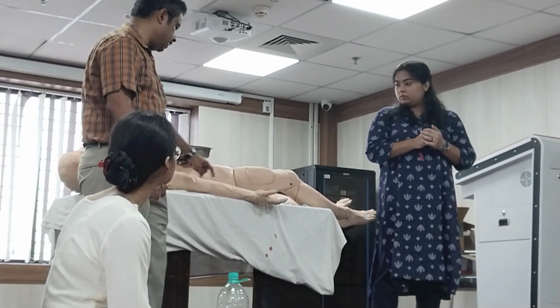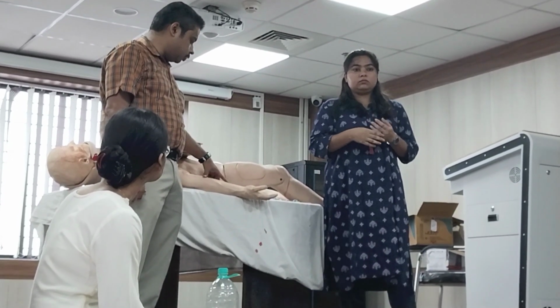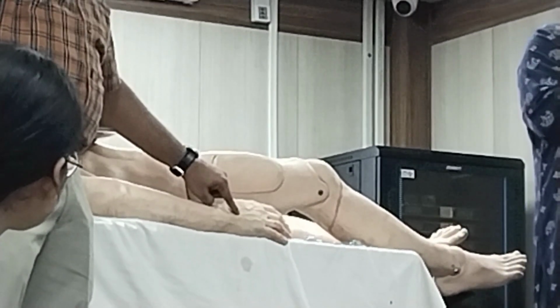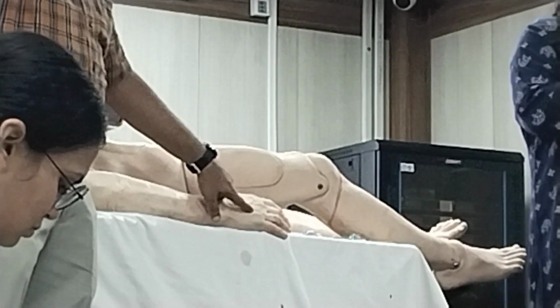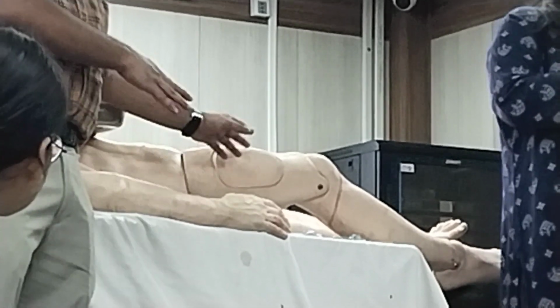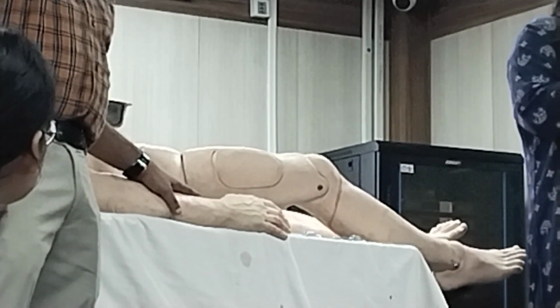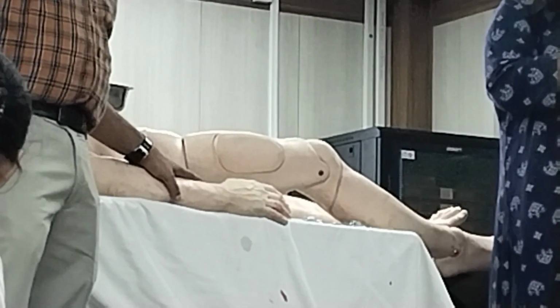As you can see here, there are some veins which are prominent and straight. We can choose them, or we can choose a straight vein like this, which will be beneficial. And you can clearly see the veins in this patient, or rather this mannequin. Patients are usually not so supportive, so they do not come with such beautiful veins. So you will have to search for the veins at times.